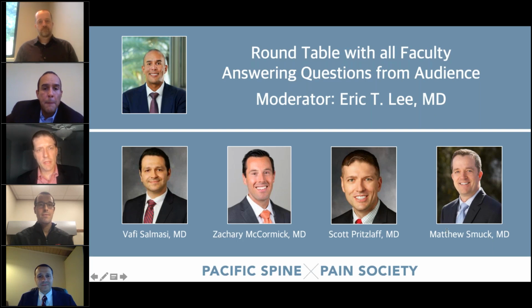No, so you should be aware of the code. I'm not going to get into the CPT code, but it's a bundle code, right, for all three. When you start doing things like the shoulder or the hip, you're reimbursed for your first burn or your first ablation, and then usually 50% for each additional. Dr. McCormick really, and he's very modest, has published on cooled RFA of the knee a couple of years back. The modality you're using affects the reimbursement, meaning you really have to do the financial analysis if you're going to use some of these kits that can be extremely expensive.